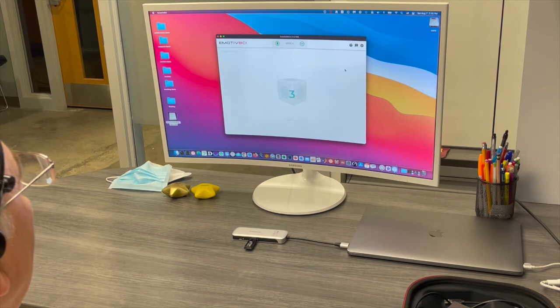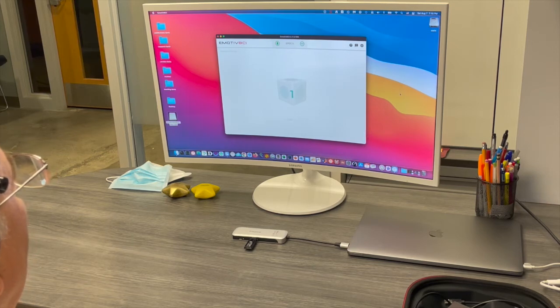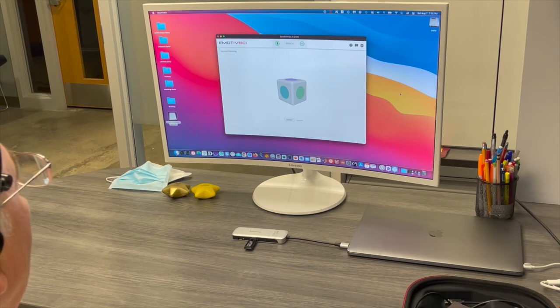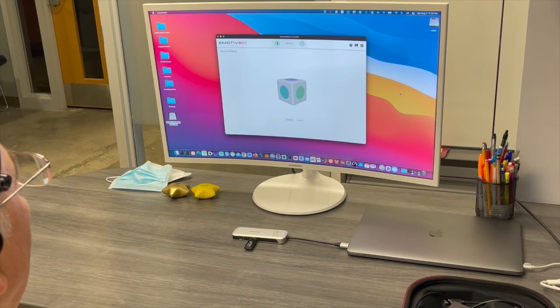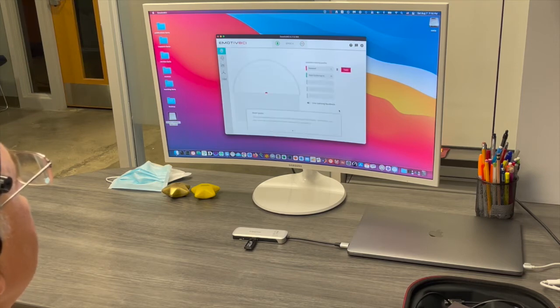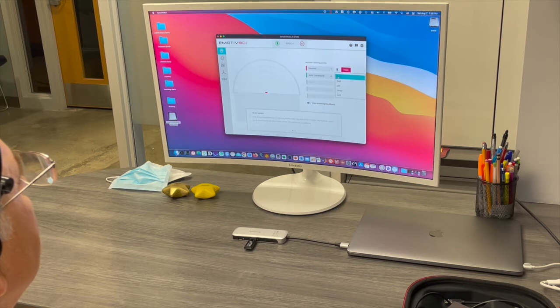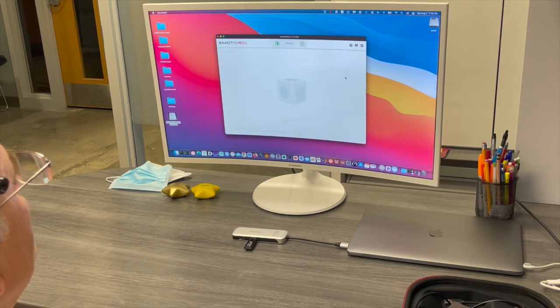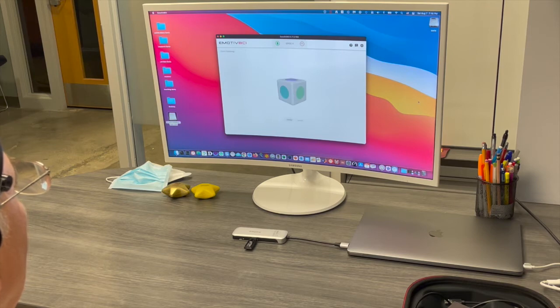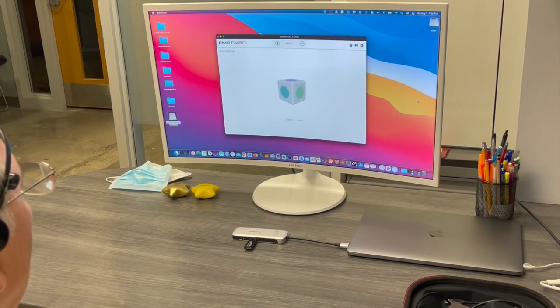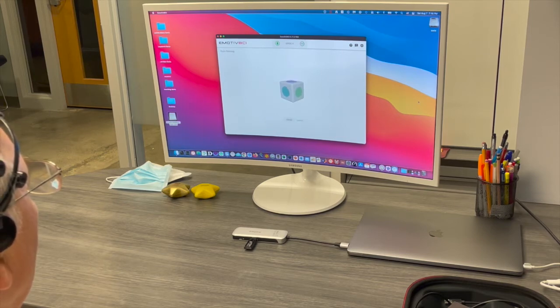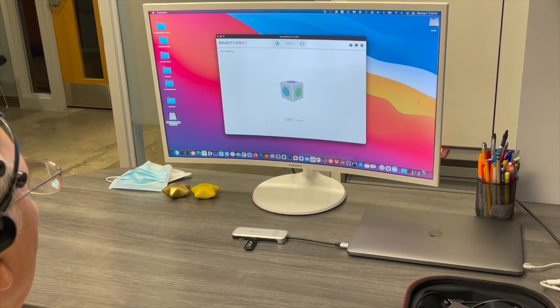It is not moving because during the training, the cube just sits there. And you have to be very careful about training because the first two trainings for every single option you have are crucial for the neural network behavior.